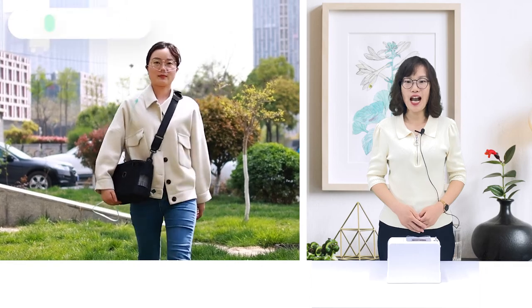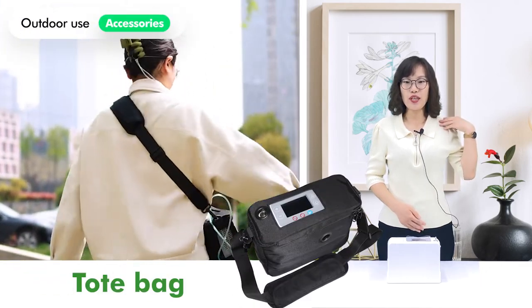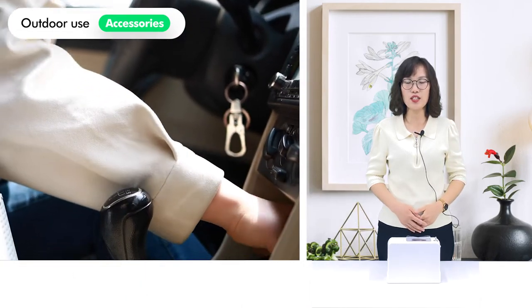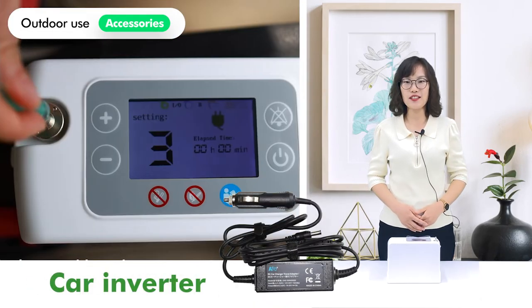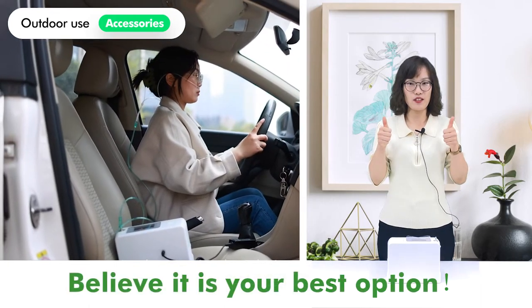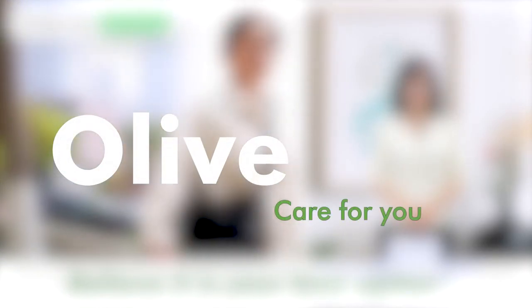When you are outdoors, you can pair it with a stylish bag with adjustable shoulder straps, or use it with a car adapter. Believe it is your best option. Olive — care for you.